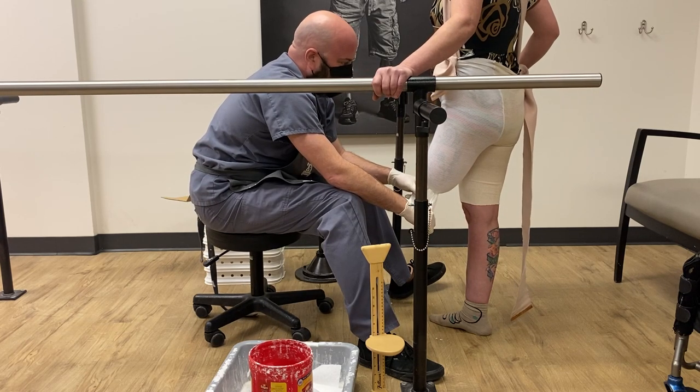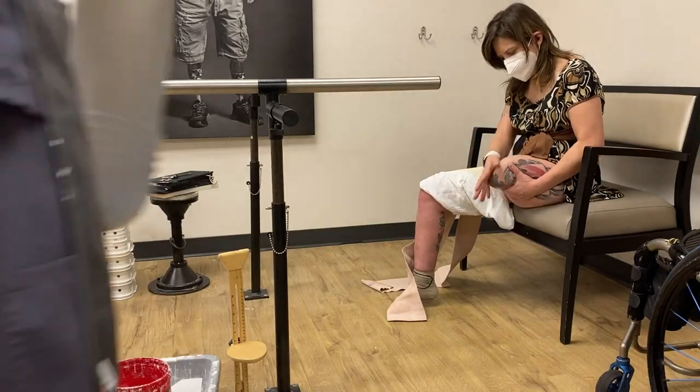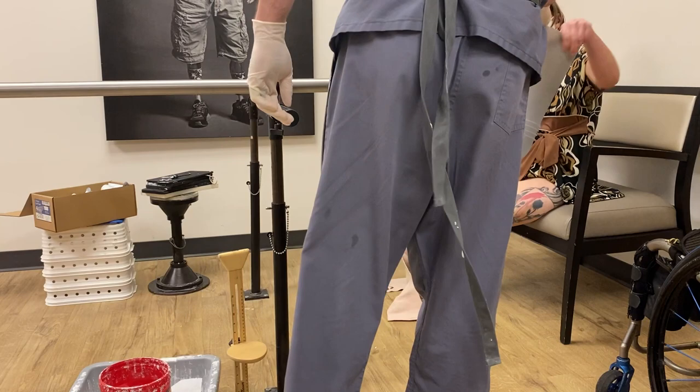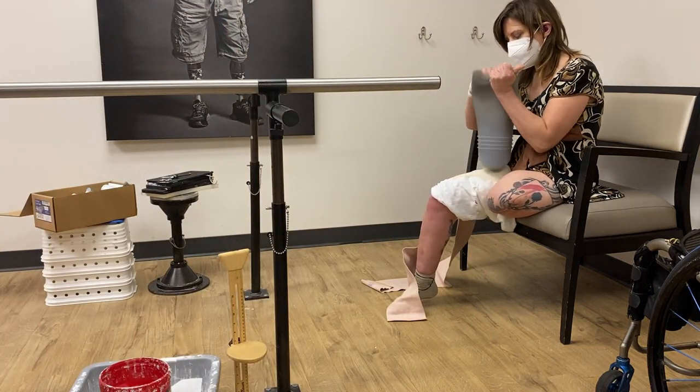We're not doing the skin fit one this way — we need to put your liner on. Put this on and mark it, and just cut it. We're gonna have to cut it.